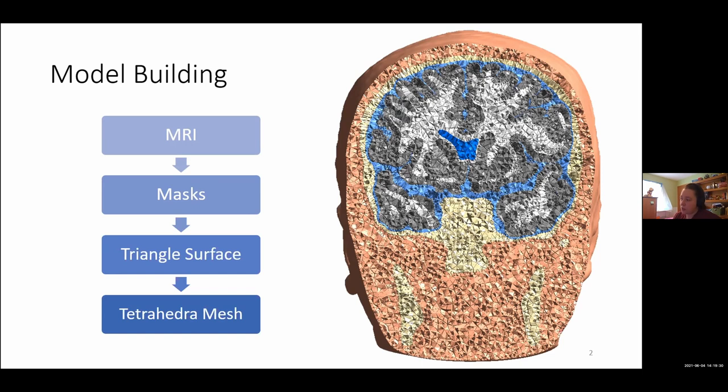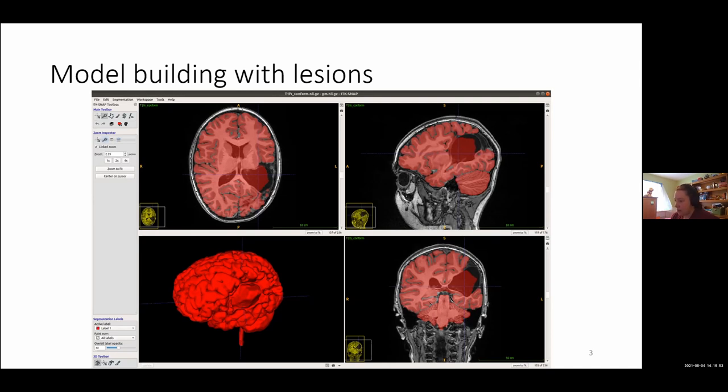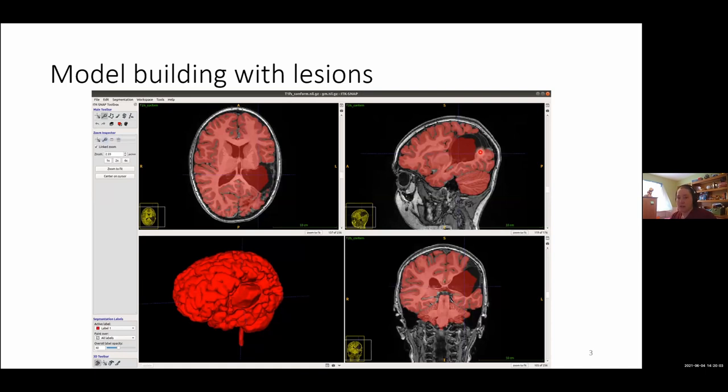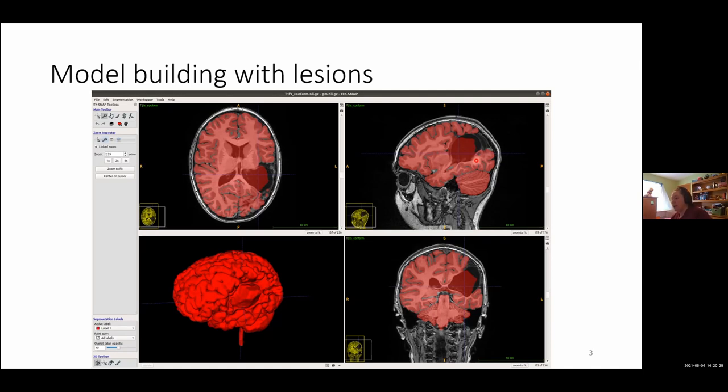And this works really well for what I'll call a typical human model that you want to build. But problems do arise when you have non-standard models. So if you have a human with pathology, in this case, this person had a stroke lesion. Here's a large lesion where you would expect to see gray matter and white matter is now just a void. Typically, we consider that to be filled with CSF.